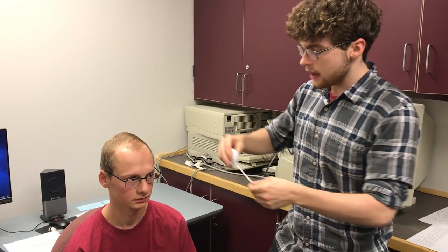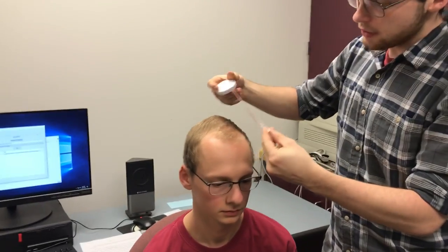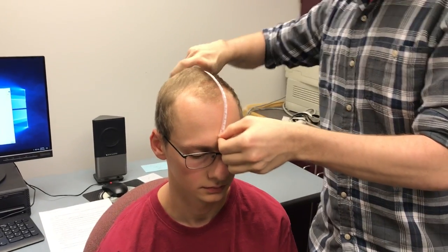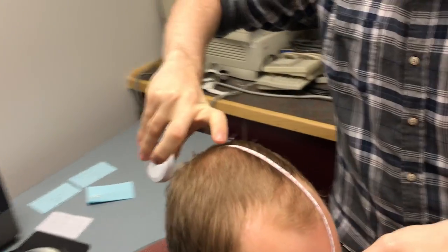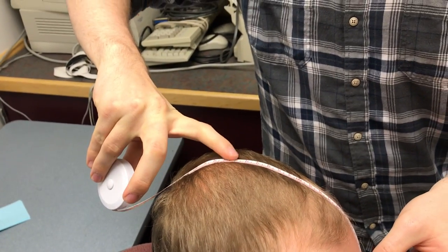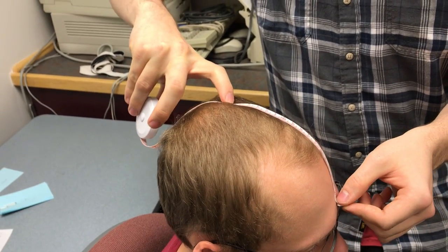The first thing you want to do when you have the participant here is measure their head in centimeters and find the midpoint. In this case it's probably around 15 and a half to 16, right around here.